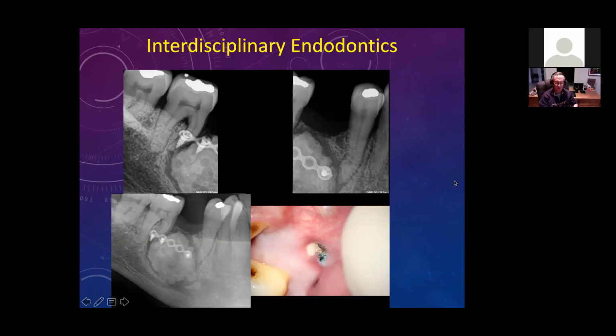This patient was referred to me by a periodontist. Some of you may know him, Ken Kruger, a really outstanding periodontist who practices on the other side of San Antonio. We work together quite a bit. He referred this patient to me. The history is about 2 years earlier, the patient had, quote, a cyst removed and had the area grafted. As you might suspect, this was done by an oral maxillofacial surgeon. Periodontists don't usually put screws and meshes and things in there.